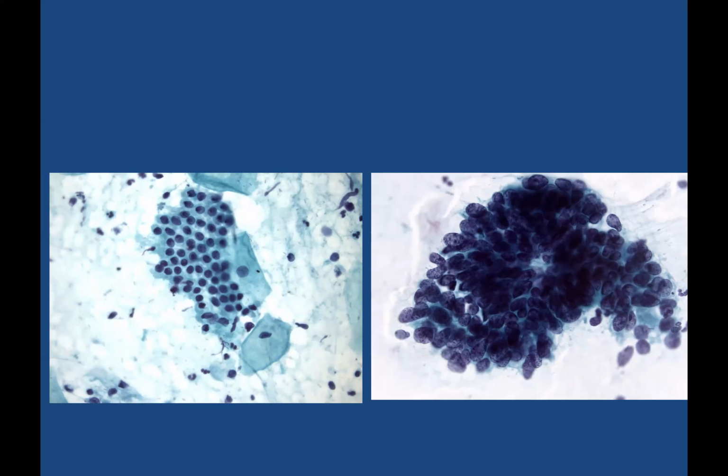So I'm going to show you some cytology now, and this is the corollary. So normal on our left, a nice flat monolayer. On the right, this is high-grade CGIN. And again, back to our wine bottles in a wine rack, the best way to imagine this is now we're trying to cram too many wine bottles into each of those wine rack openings.